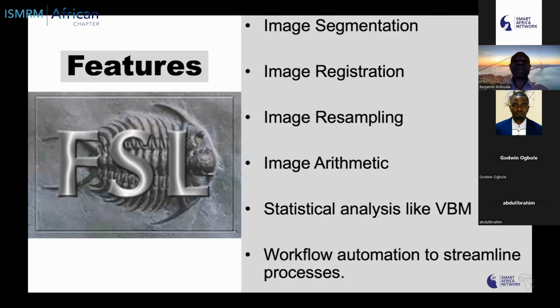In the area of image segmentation, I quickly mention that most of the tools that I present today allow you to do image segmentation and registration. And image segmentation is nothing but separating your MRI images, focusing on brain images now, into different chunks depending on your target. So for example, I can see image segmentation actually from about 4 different perspectives.